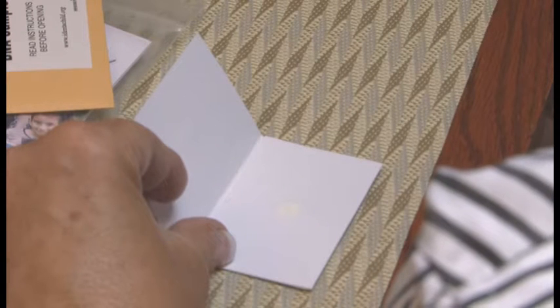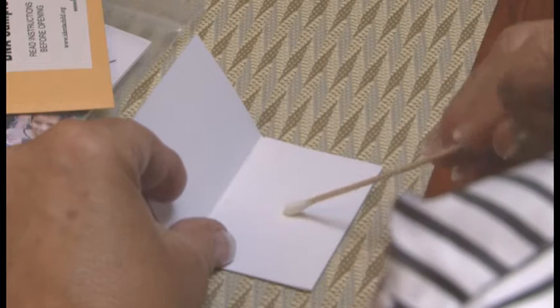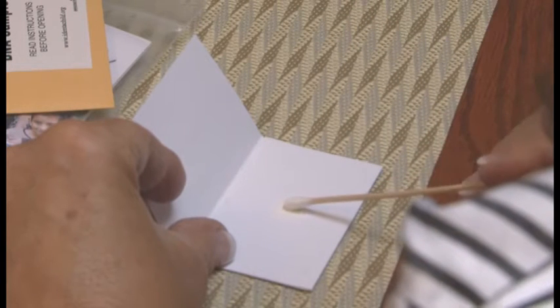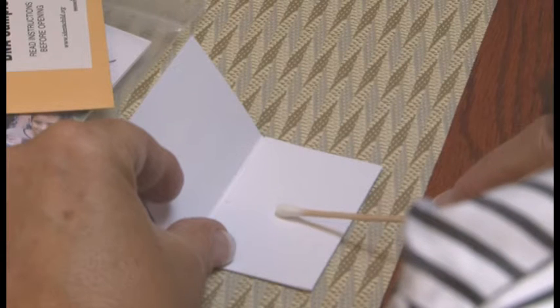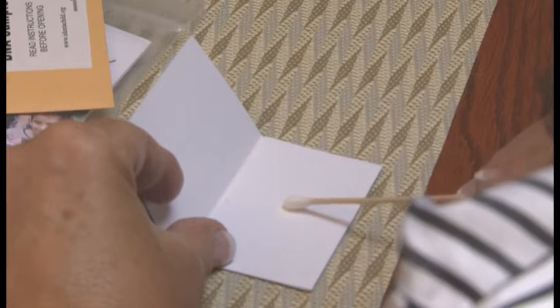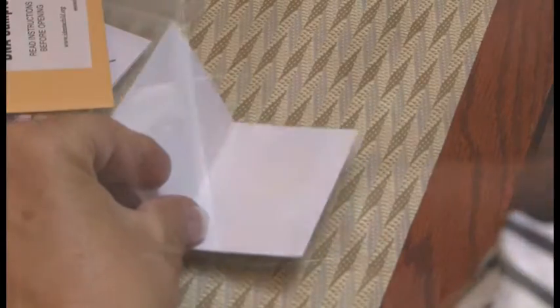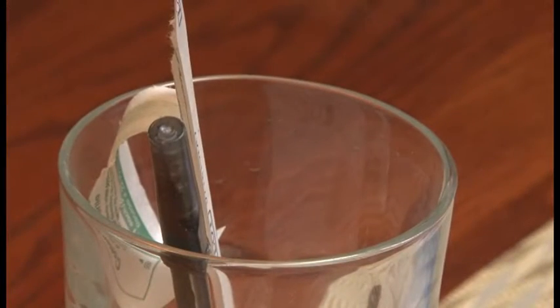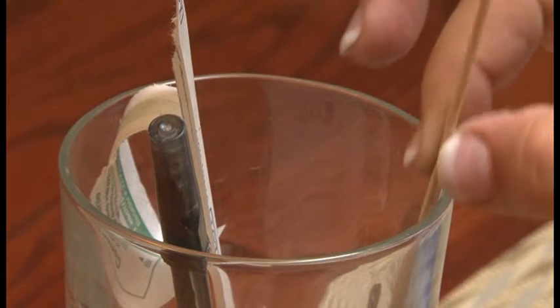Now, gently but firmly press the cotton swab in a side-to-side motion onto the circle of FTA paper to completely saturate the sample area. Nothing magical happens here, and there is very little visual difference in the transfer process. Now here's why you needed the empty glass. Put the swab in the glass, swab end up, to let it dry.